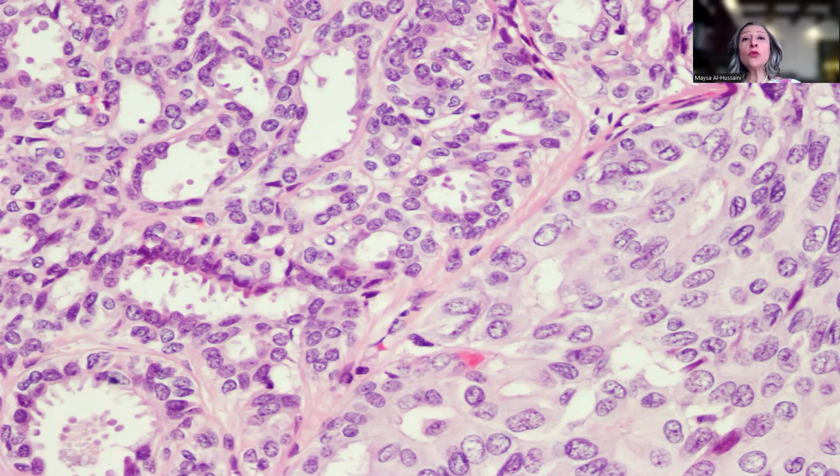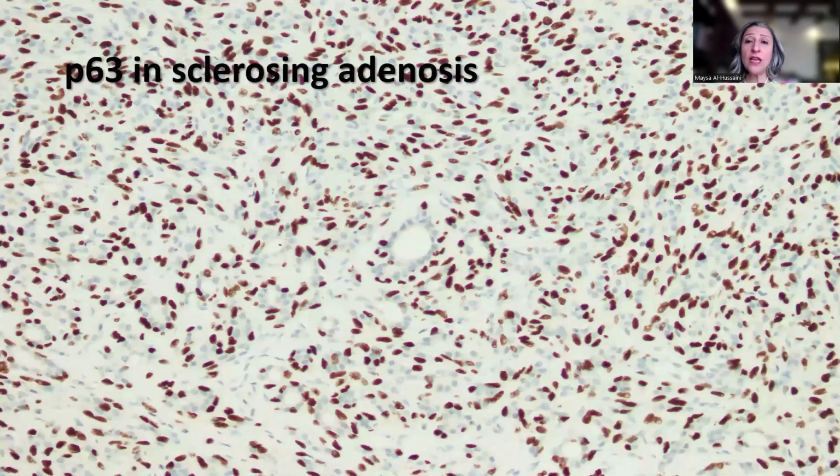But in order to ensure that we are really rendering the proper diagnosis, and remember, this is extremely important, especially if we have limited biopsy, not to overcall or undercall the lesion, and also whenever we have excisional biopsy, in order to estimate the proper size of the invasive component, we have always to exclude the benign component, especially when it is at the edges of the lesion.